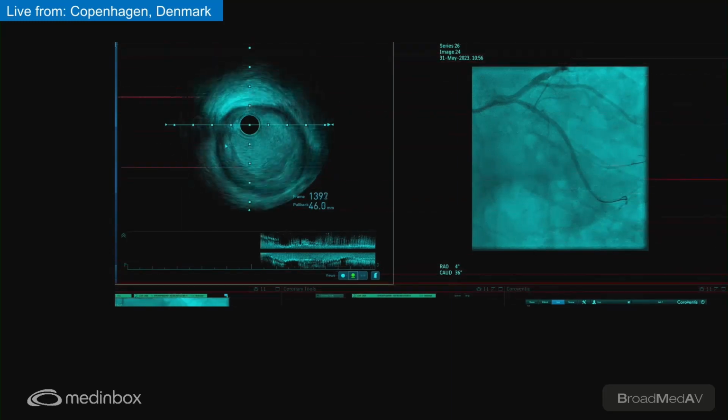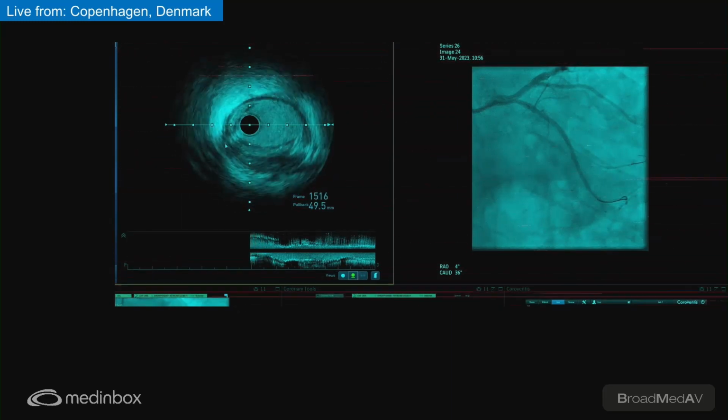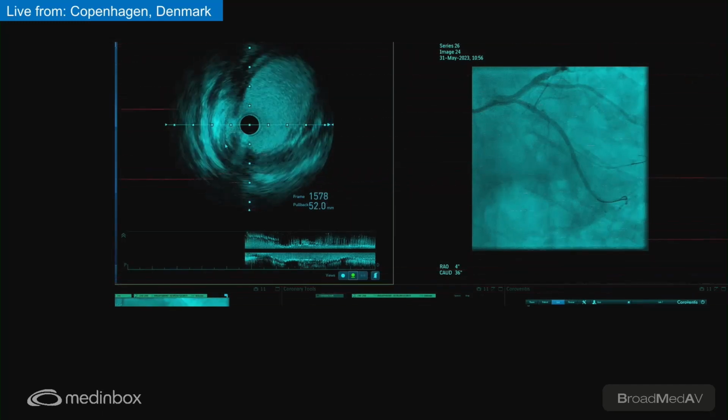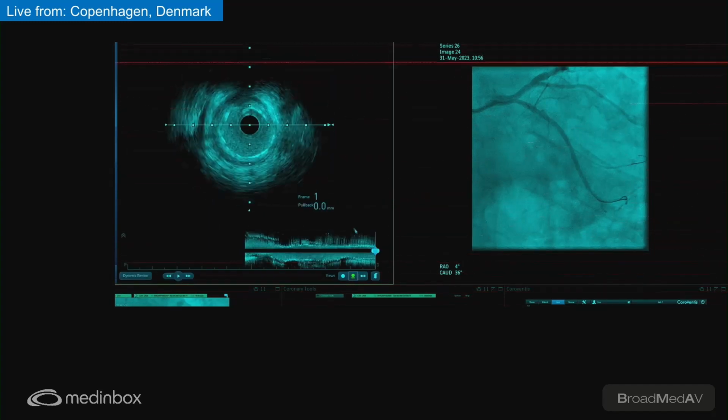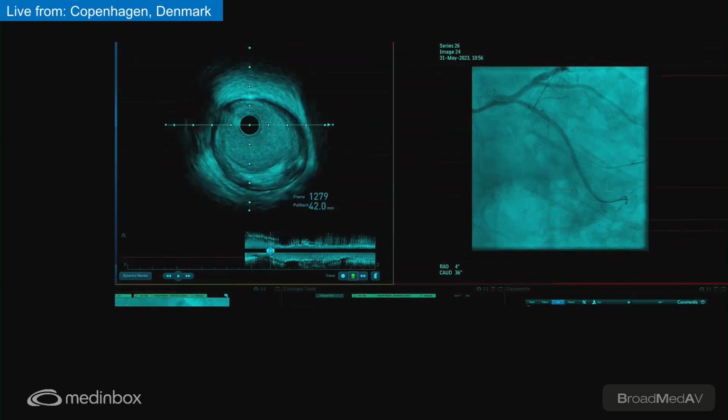Here we are proximal to the stent. Just need to check the landings. We see here there's quite a plaque at the ostium of the circ. We want to avoid stenting it. It's not significant, and we end the proximal part of the stent in a part of the vessel where we have less than 50% plaque according to the ULTIMATE criteria.